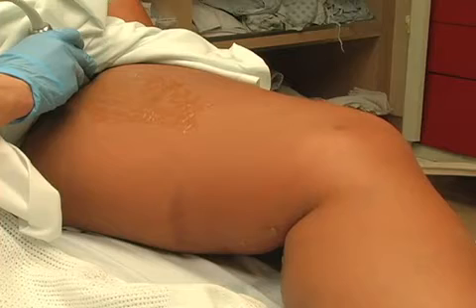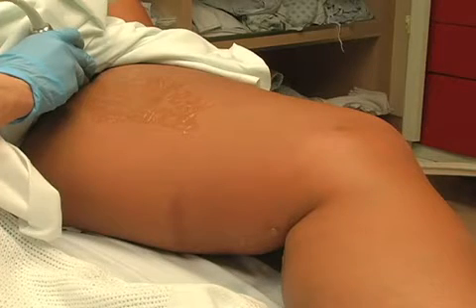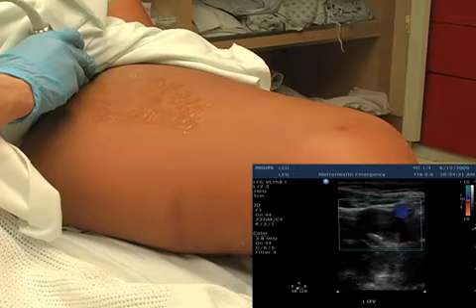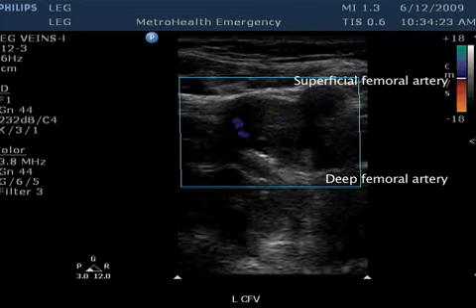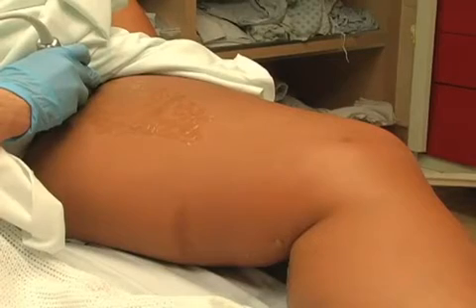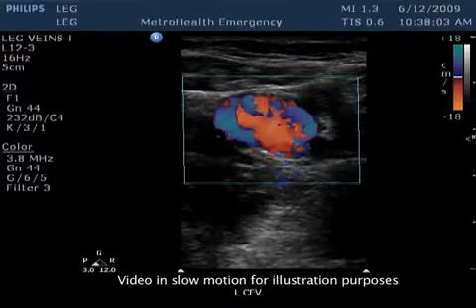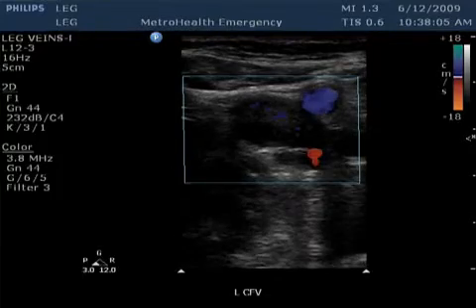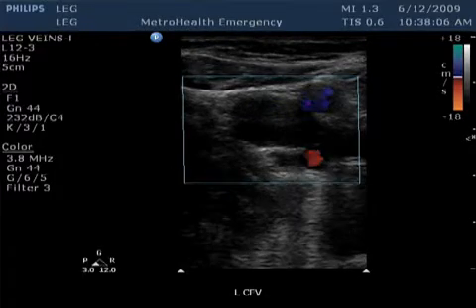In a negative study, the use of venous augmentation can provide the clinician with additional evidence of venous patency. With the linear probe positioned transversely across the femoral vein, turn on the color Doppler function. The pulsatility of the artery should clearly be evident. With the other hand, quickly squeeze the patient's calf. This produces a bolus of blood that is propelled toward the heart and is seen near simultaneously as a color blush that completely fills the vein.